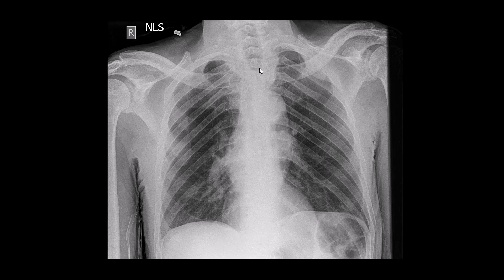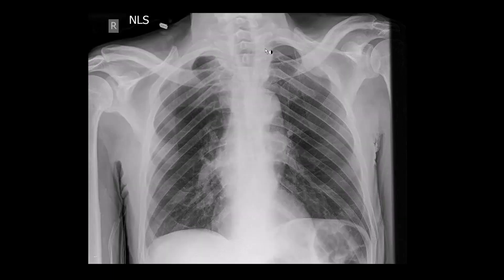The main finding here is some widening of the superior mediastinum, in particular on the left. While this could be secondary to vascularity, it does raise suspicion of the possibility of a mass or adenopathy, especially in the left more so than right paratracheal region.